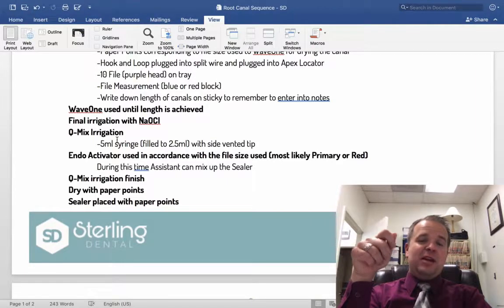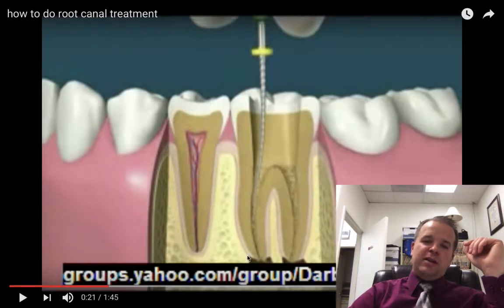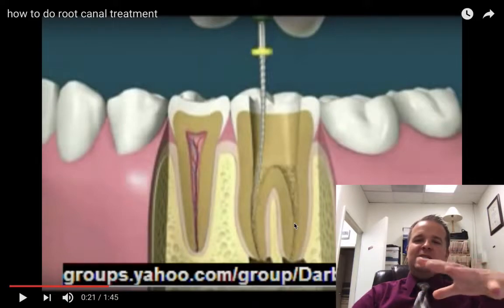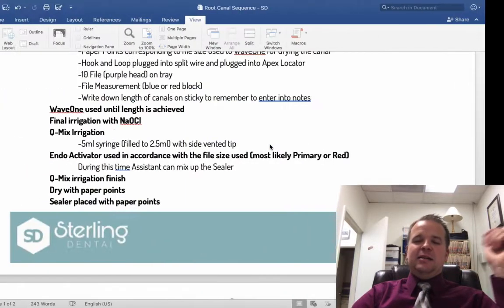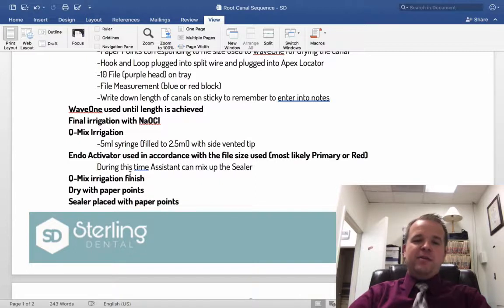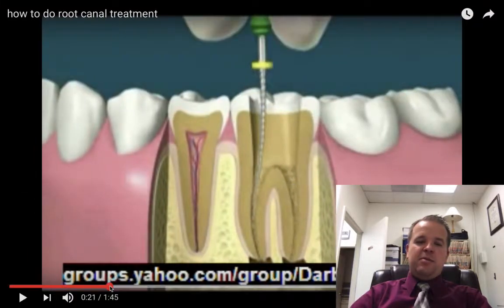You'll make sure that everything is dried out with the paper point, so that inside of the tooth there's no bleach or anything. So you use these little miniature paper points that go all the way down, and everything's isolated and dry. Once that's done, then you will mix up some sealer, most likely once he or she's using the endo activator, and make sure that everything is cleaned out, irrigated out completely. Then you'll do your final irrigation with Q-Mix, dry it, and then place sealer, and then the gutta percha all the way down to the bottom of the tooth. And that's what it'll look like.